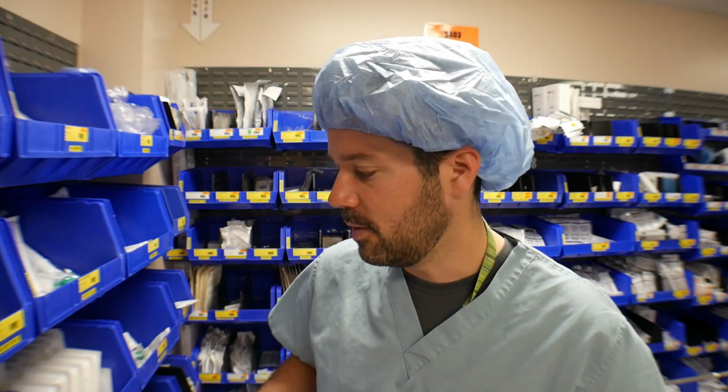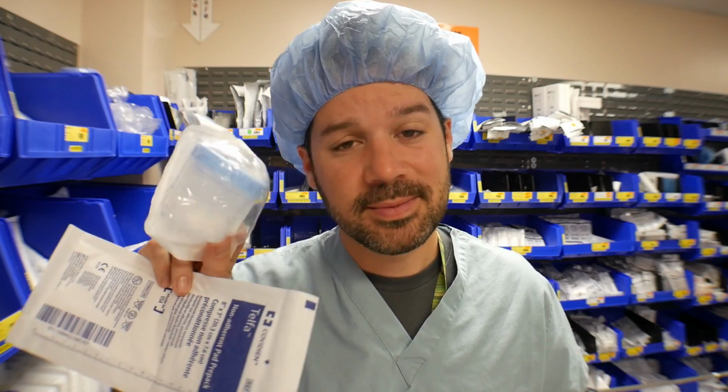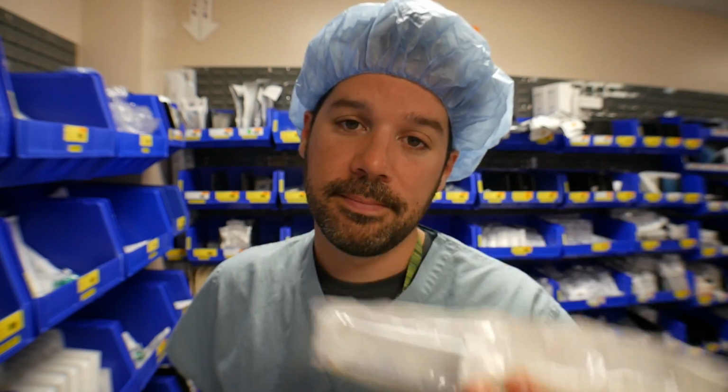Never a Raytec. Always use a non-adherent pad, a specimen cup like this, or if it's some fluid, we just have a fluid mucus trap. So there are three main ways to determine the diagnosis of a specimen. In the OR, we usually hear things like the frozen section or fresh frozen section, the permanent specimen, and sending a specimen out for cultures.